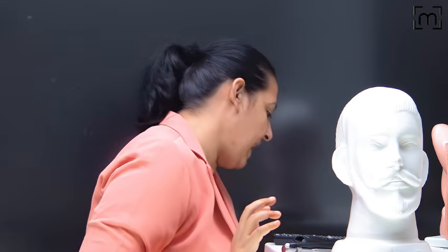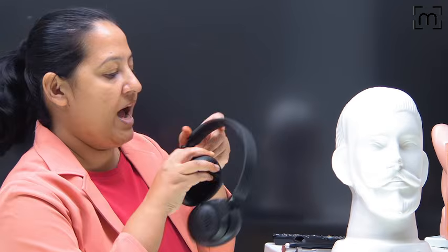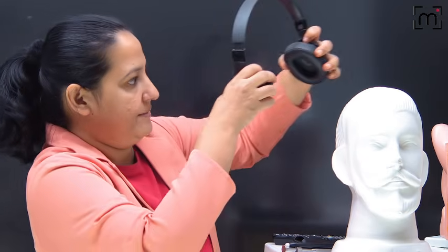This is my patient. Now in this patient, I want to perform SRT. I will take a headphone and put it in the ears of my patient, and I will play spondee words.